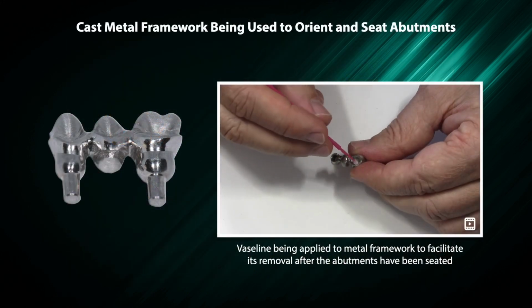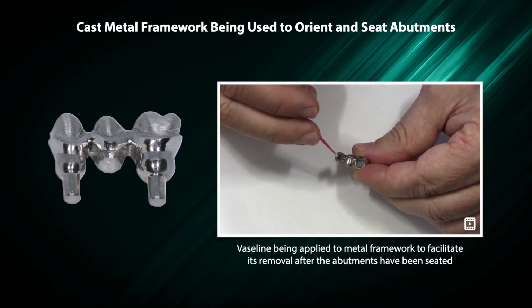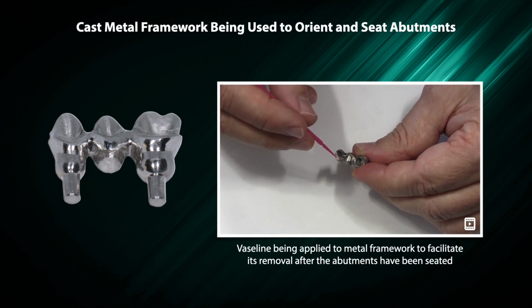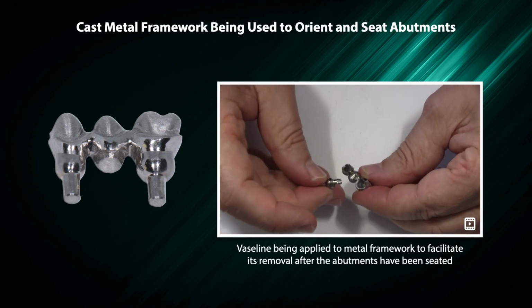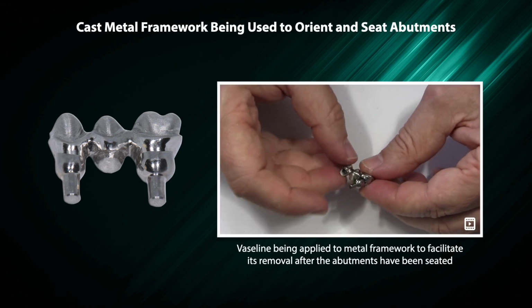Cast metal framework being used to orient and seat abutments. Vaseline being applied to the metal framework to facilitate its removal after the abutments have been seated.